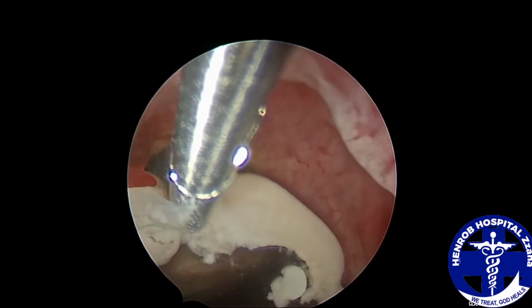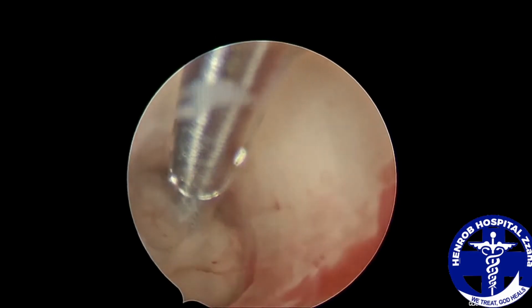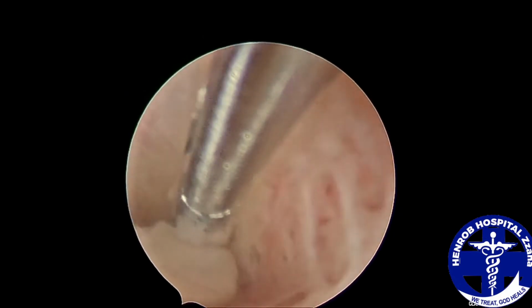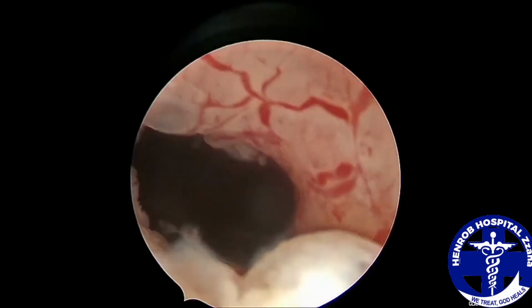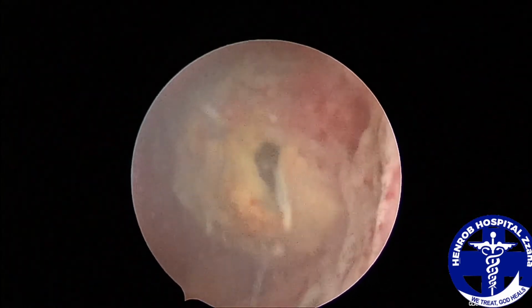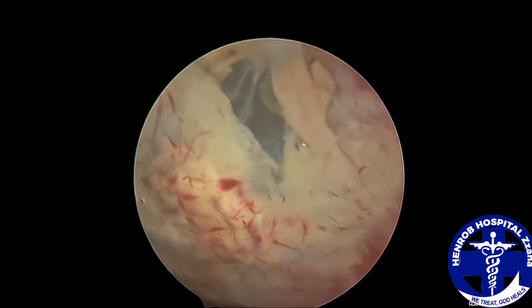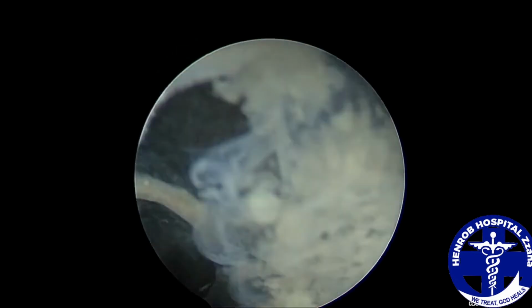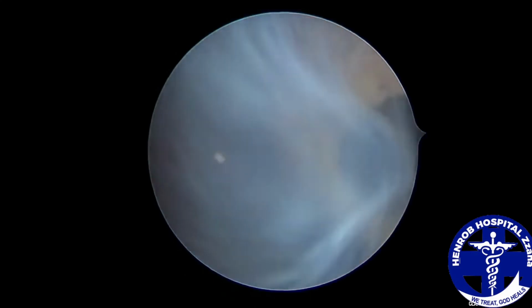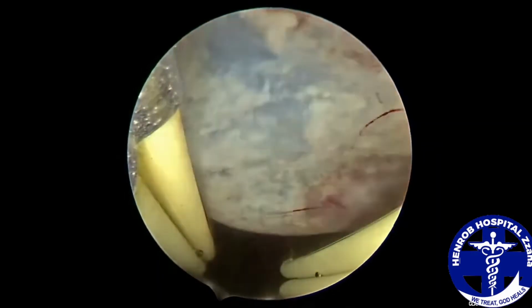For both morphological evaluation and cytogenetic evaluation, to look for the causes of fetal demise. At the same time, using this method, you can carry out a directed visual evaluation of the products of conception without having to do blunt curettage of the uterus, that is associated with the complications of infertility due to Asherman syndrome.